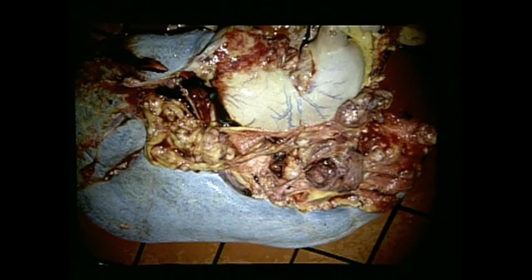And the stomach was diagnosed as a fibrosarcoma, but that easily could also have been misdiagnosed because it could be as well a gastrointestinal stromal tumor, which again, when subjected to certain markers, is made up of myogenic and neurogenic cells. But anyhow, we made the diagnosis of a fibrosarcoma because of the whirly, bundling appearance of elongated cells that at least to us looked very much suggestive of a fibrosarcoma.